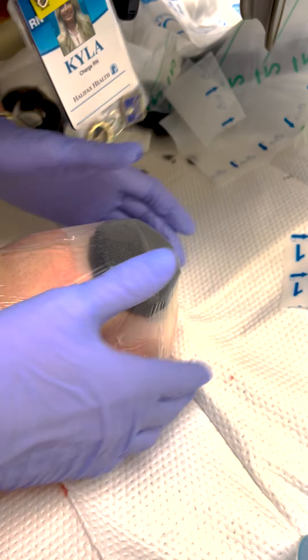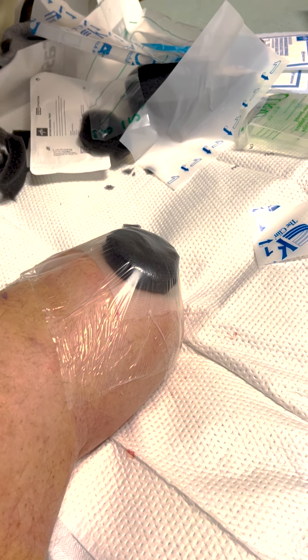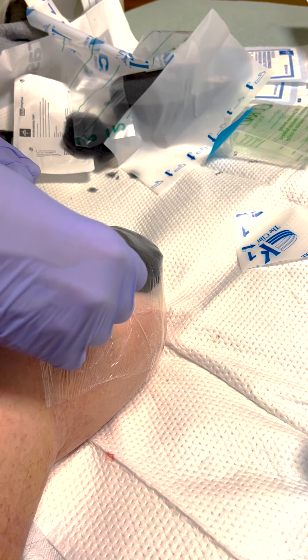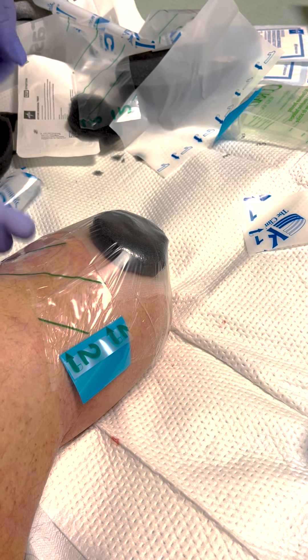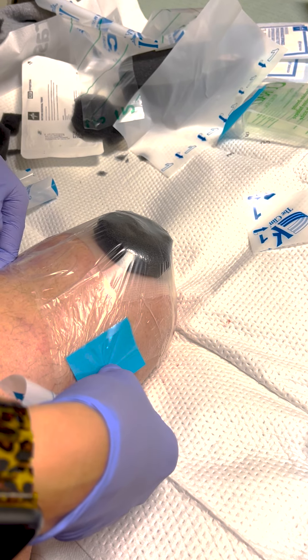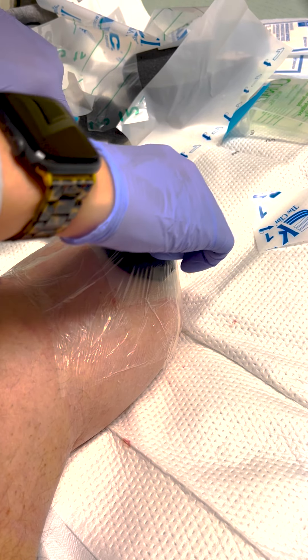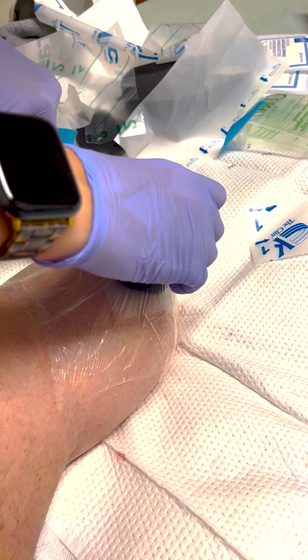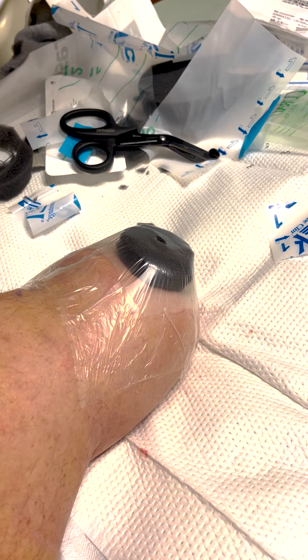Then we're going to patch up all the little spots that weren't kept wrinkle-free. We'll probably do one just right across here. The wound vac will be put on it and then the vacuum pump will give 125 millimeters of mercury of negative pressure on the wound. I should probably do some research on why it's 125 millimeters of mercury — I don't even know. Sometimes they have it set to 125, other times it's only at 100, so it kind of depends.